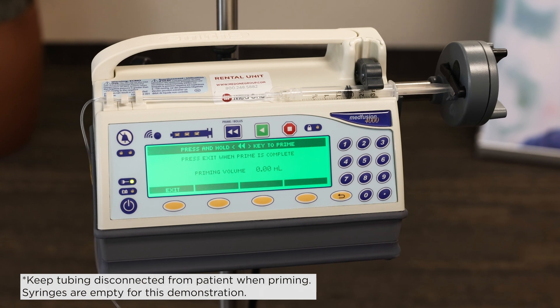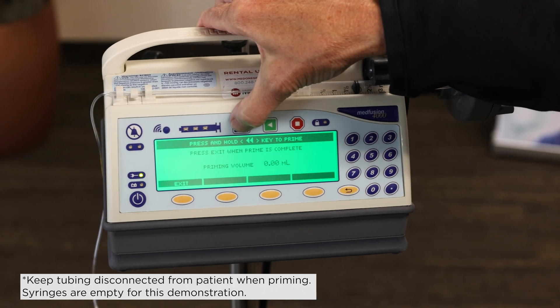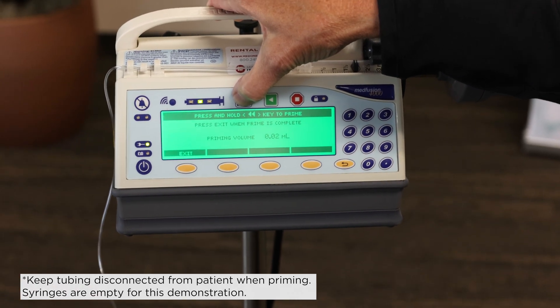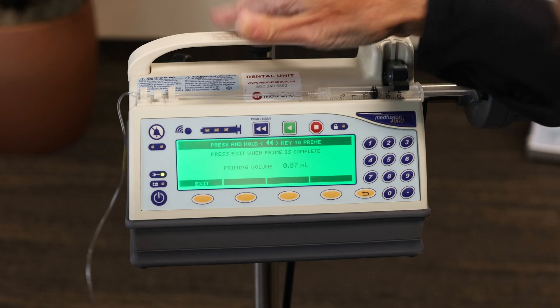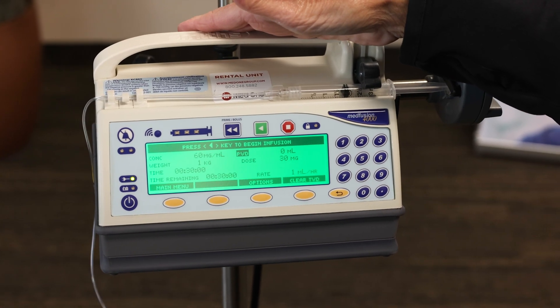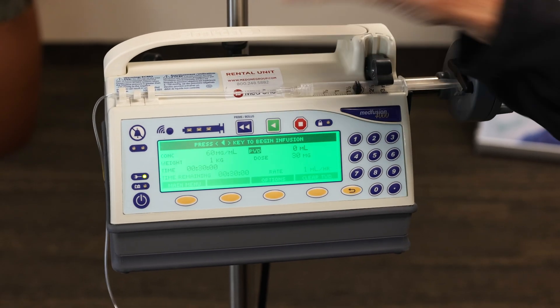Before I press anything else, I've got to press my prime and bolus key. You will press and hold that down until you see fluid come to the end of your tubing — or whatever the priming volume is on the set you're using — once it reaches that. When you see that, let go, then go back and press the exit button. Now we're ready to connect it to our baby and press the green button to start.